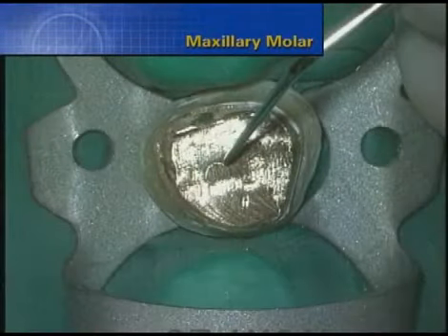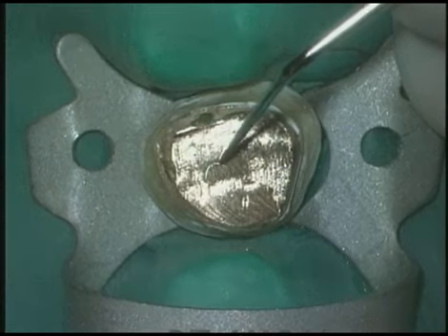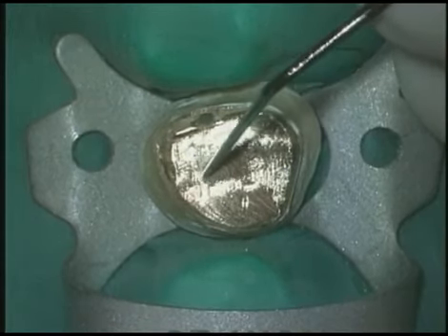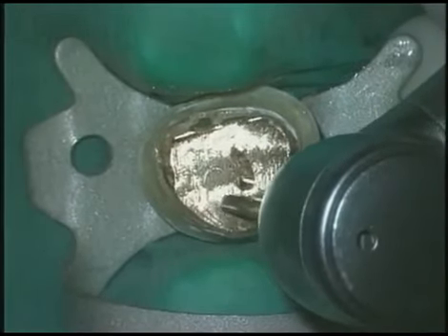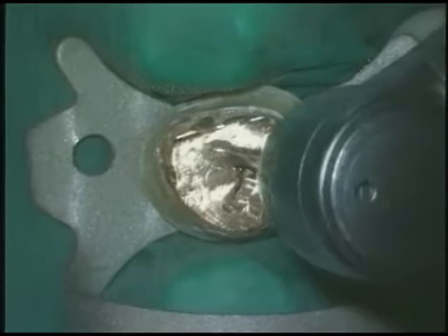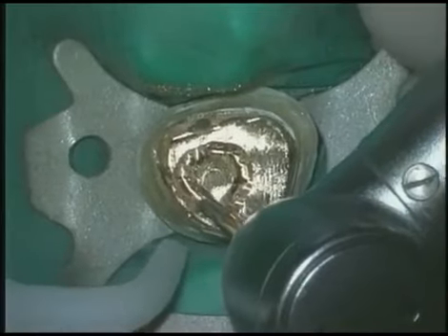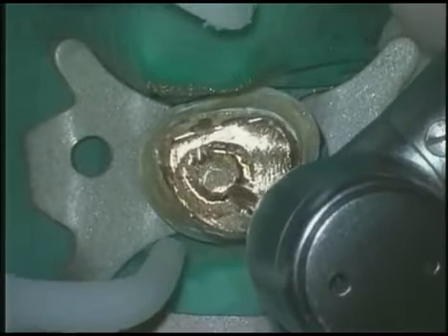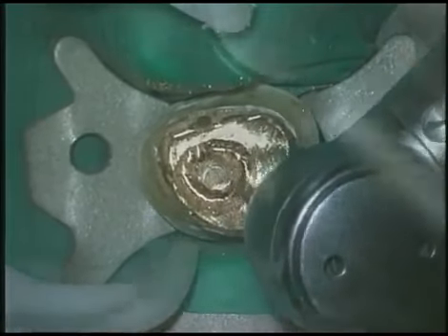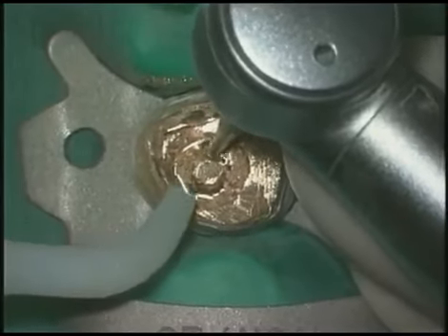Now let's look at a maxillary molar with a cast gold core and interlocking post systems. My checklist is to think, plan, visualize, execute. The Explorer outlines the palatal post. Transmetal burrs are again employed, but notice that I am removing core material quite far away from the actual palatal post. The burrs tend to chatter as we cut on gold, and if we chatter, we can bounce into the post and we could needlessly reduce its cross-sectional size.